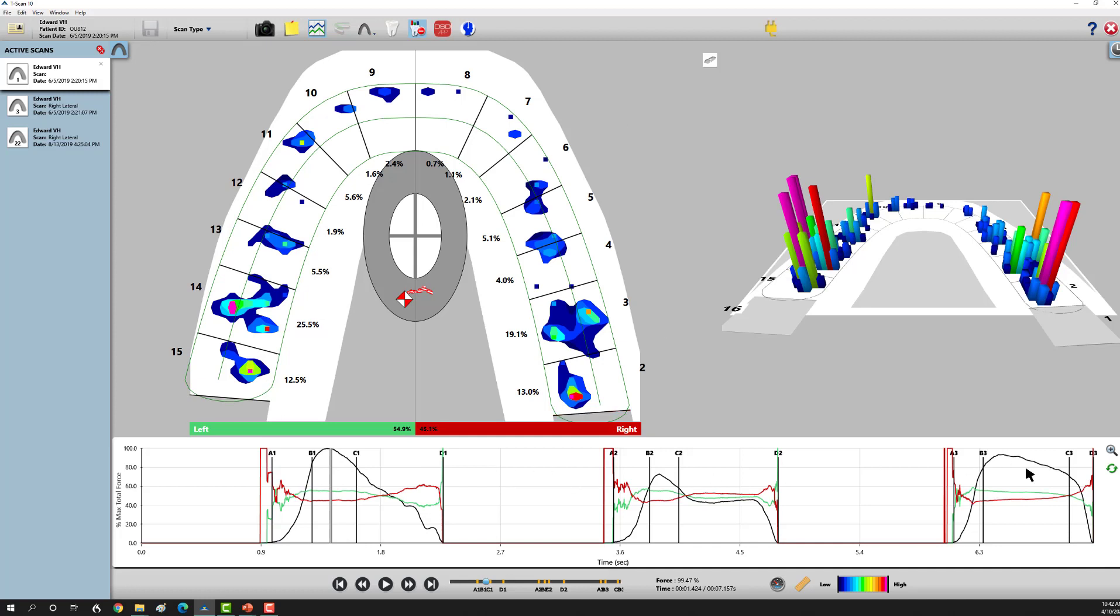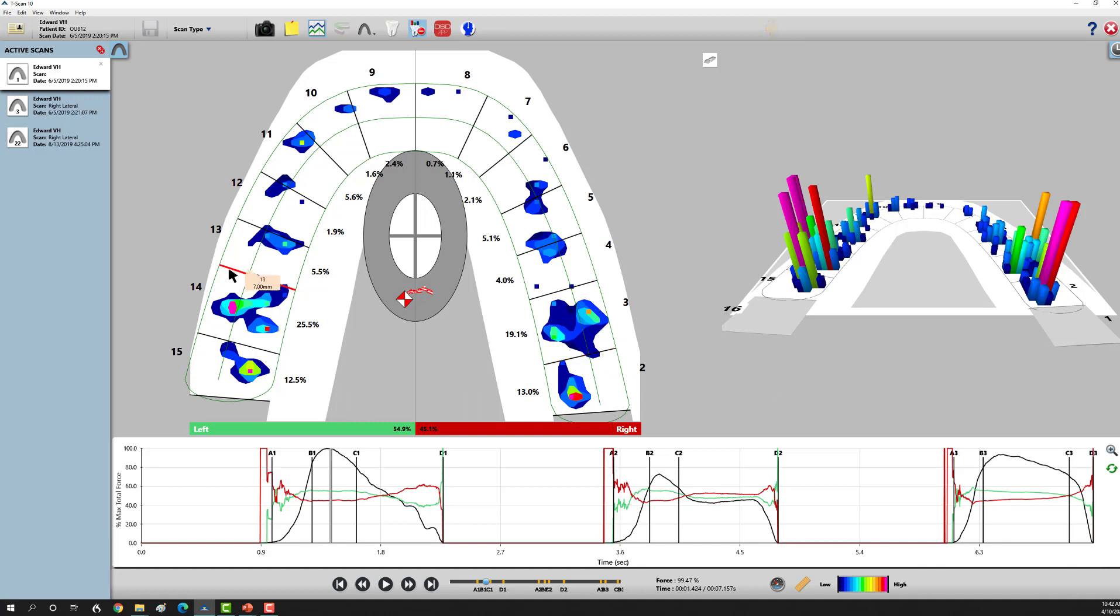We do three bites in MIP, or maximum intercuspation, and this is our data layout. Right off the bat, what sticks out to me is we have a quarter of his bite on tooth number 3 and 30, and then a quarter of his bite on 19 and 14.